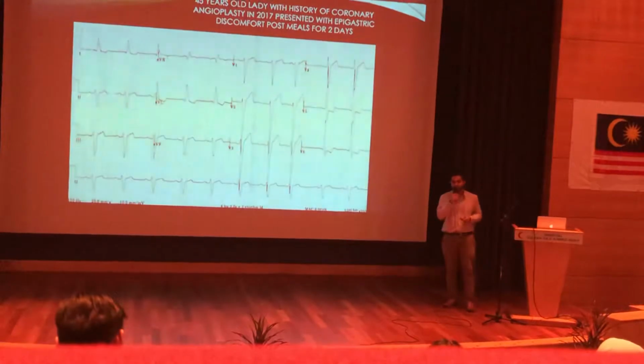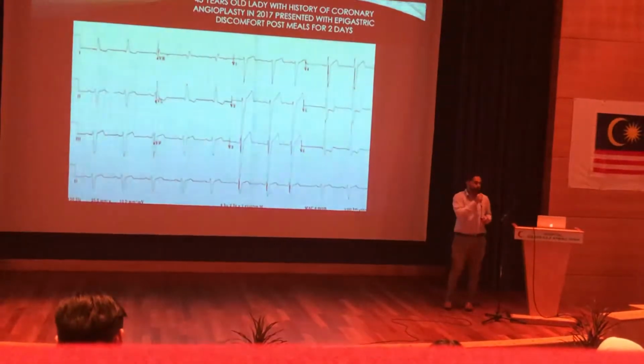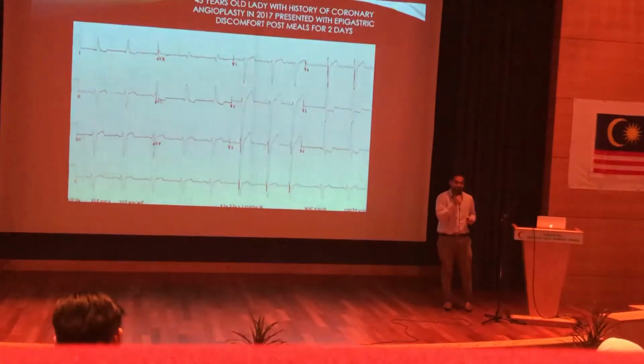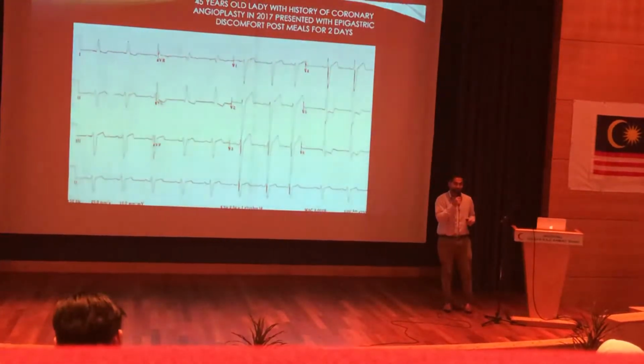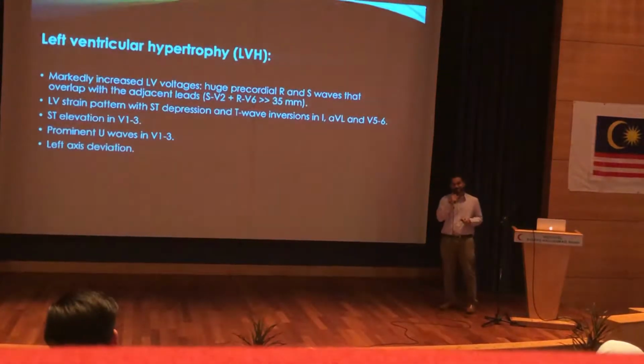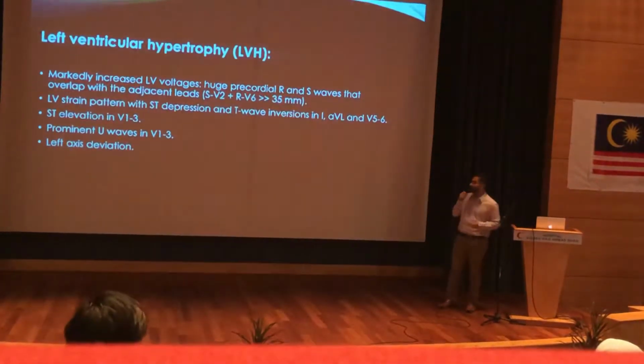I'll give you another clue. This patient's blood pressure is 200 over 110. What do you think this is? Anybody? Never mind. This is LVH. Makes sense, yeah. Okay, have a look.